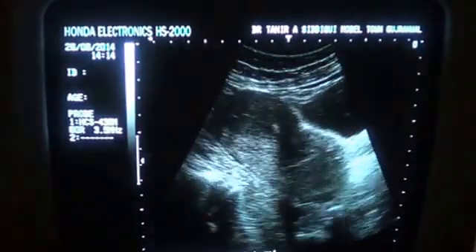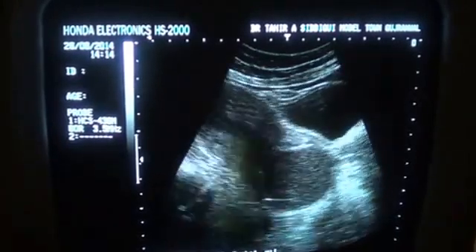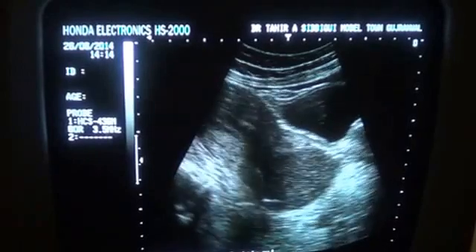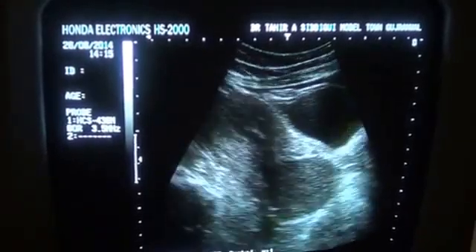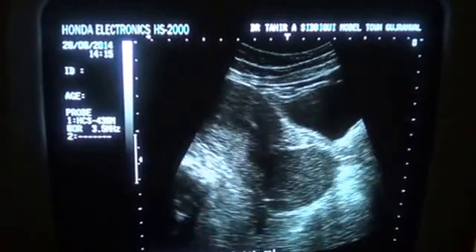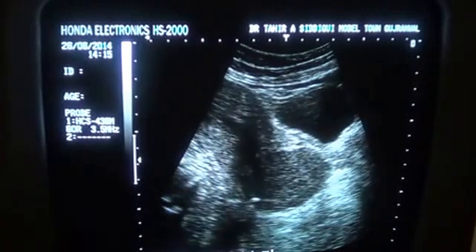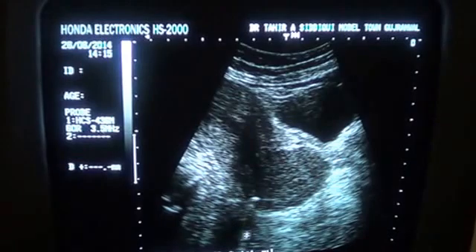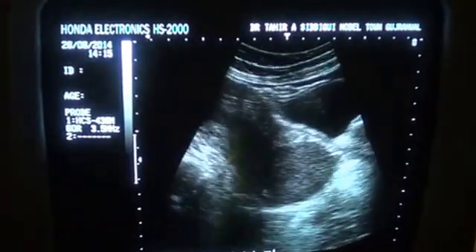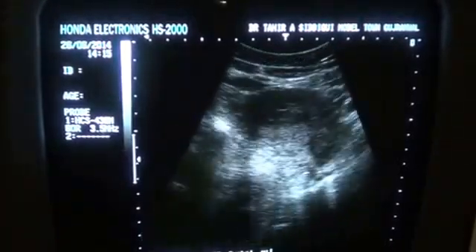There is no finding except now. Can it be a cervical fibroid? Will be a question, but if you look at the consistency of this echo-filled fluid, you can see this is small calcification giving posterior shadow within this fluid. So this is in fact, now this is the transverse section. Okay, let's see in the transverse section.